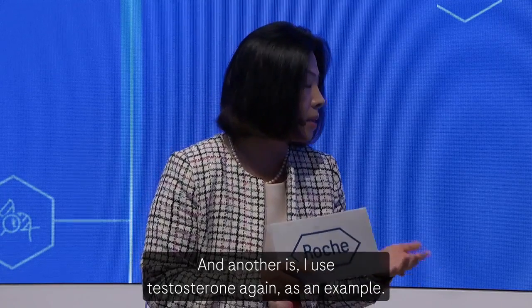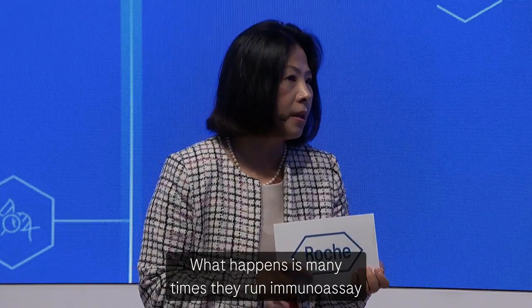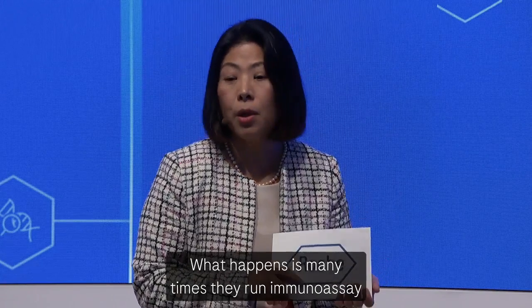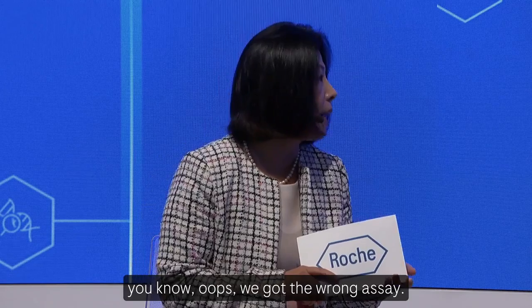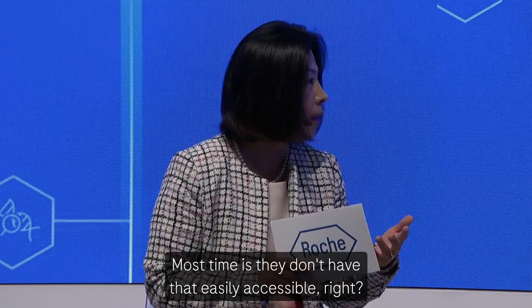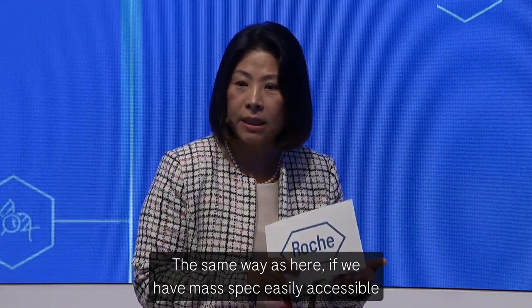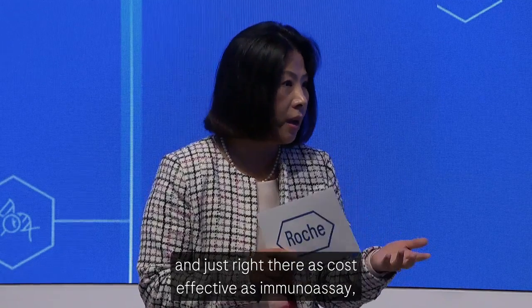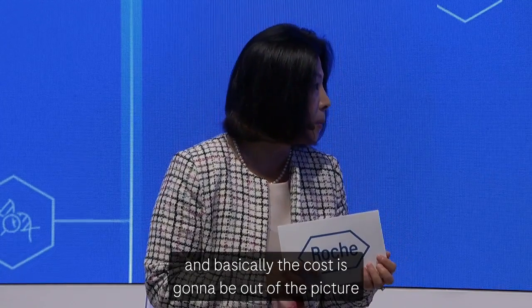Another is I use testosterone again as an example. What happens is many times we run immunoassay and the provider realizes, oops, we got the wrong assay. Most times they don't have the right one easily accessible, right? The same way here, if we have mass spec easily accessible and right there, as cost effective as immunoassay, basically the cost is going to be out of the picture.